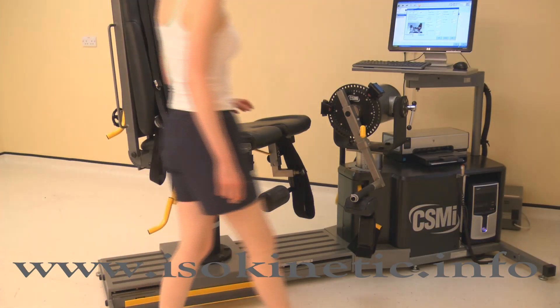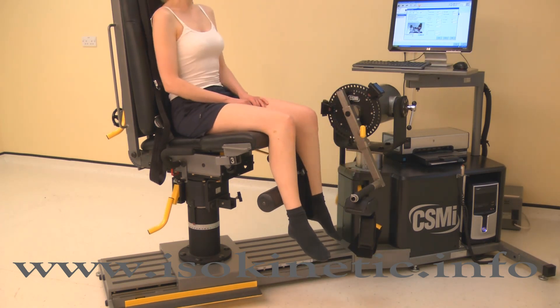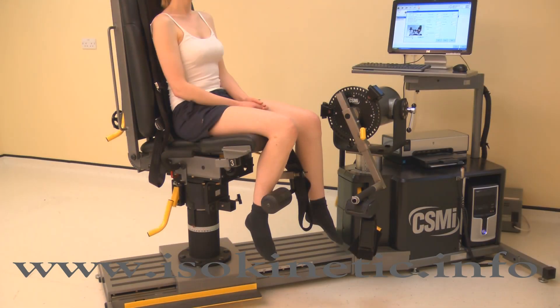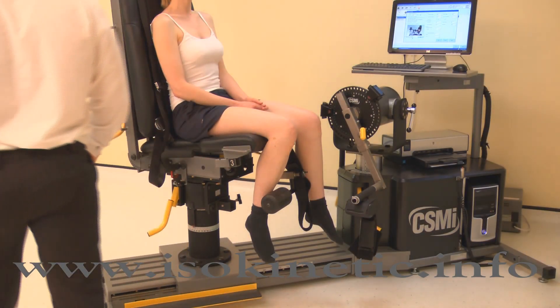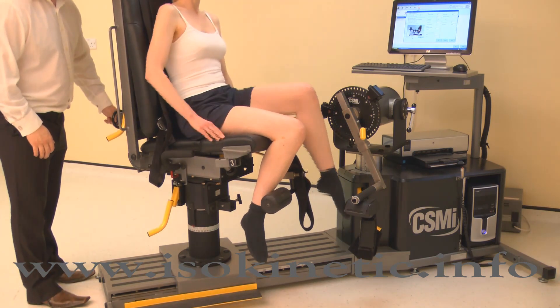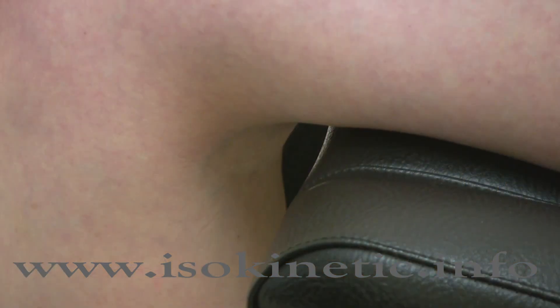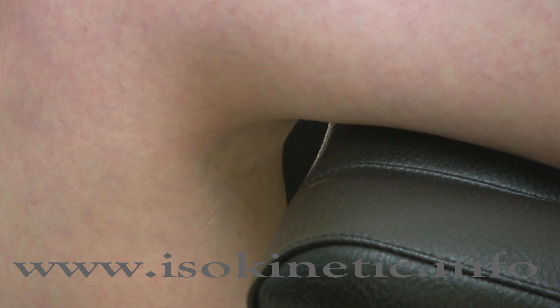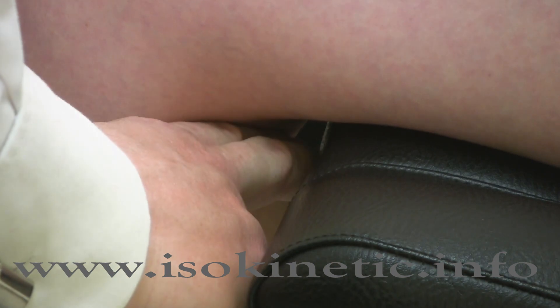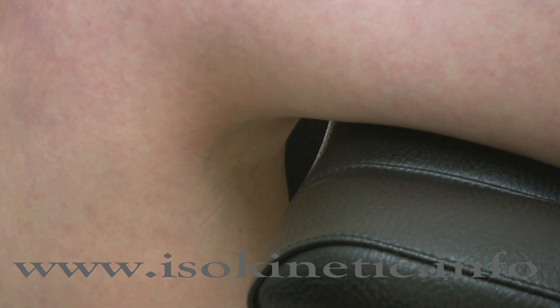Once the machine is positioned, ask the subject to be seated on the chair. Ensure the chair back translation is correct for this subject — adjusting this has the effect of altering seat bottom length. This ensures the thigh is adequately supported without impinging the posterior knee structures. Adjust the back translation until there is a gap between the calf muscle and the seat. A two-finger gap is normally sufficient for up to 100 degrees of knee flexion.